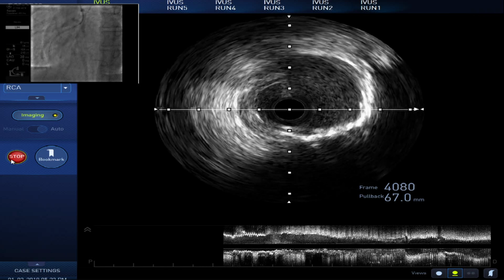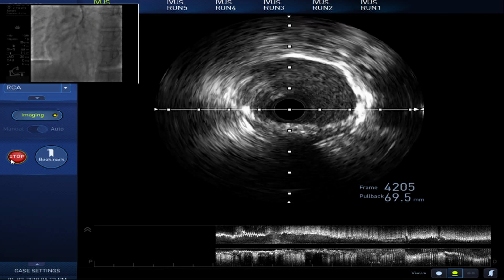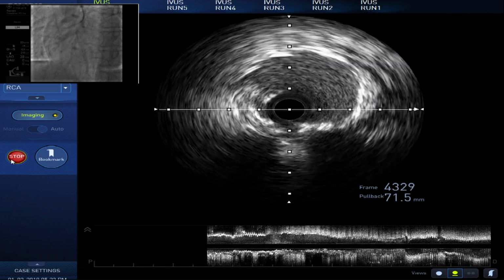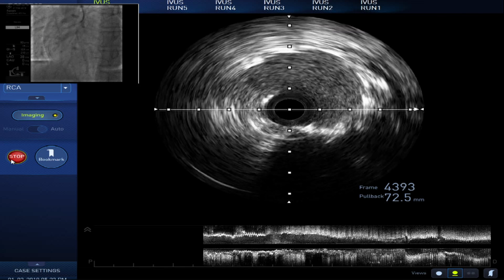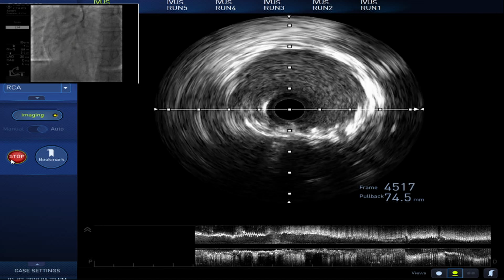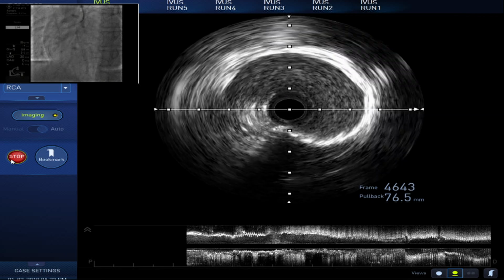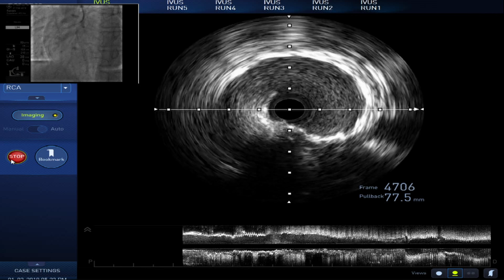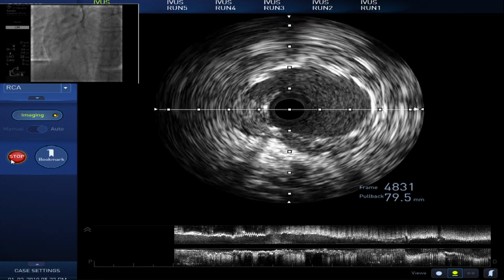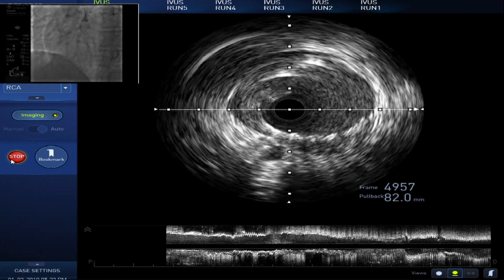Here might be the overlap. Possibly overlapping stent here. Yeah, we are overlapping. There's actually a 4.0 stent here now. The proximal stent also looks good, the 4.0, by IVUS. Some tissue prolapse, right? This might be some node, but it's okay. The proximal is also very wonderful, right?